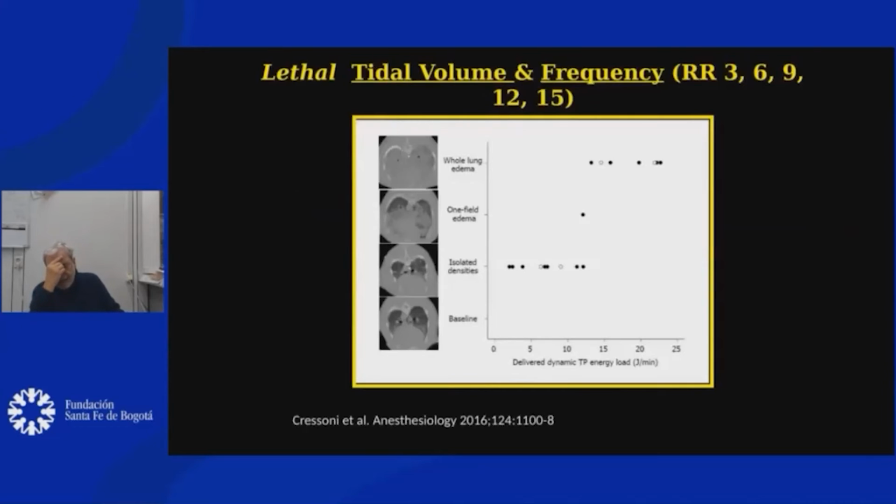If I take a set of energy per tidal volume, which I know may be a disaster at a frequency of 12, 15, if I use a frequency of 6, I don't have any problem. That means, at least in experiments, and usually our experiment lasts 48 hours, this tells you what is the relevance of the frequency.